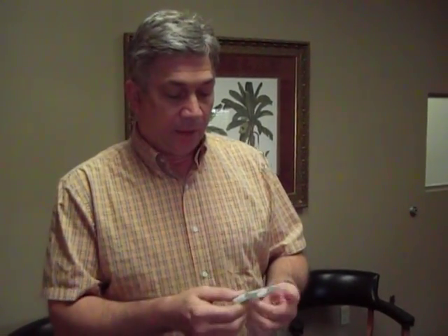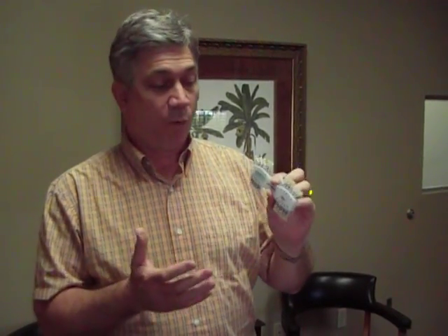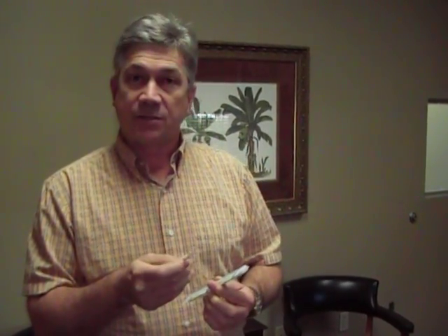And so when I walk into the dentist office to take a shade, I put this up to the patient's mouth and up to about the 1/3 of the tooth, and I quickly find out what family that tooth is in, if it's an A group or the B group or whatever, and I can quickly find out, is it an A1 or an A2? And so I figure out, all right, I pull out the A2, so the gingival third of that tooth is an A2, and then I look at the incisal. Is it still an A2 or is it an A1? Then the shade goes up to an A1 or maybe a BL4 or BL3.